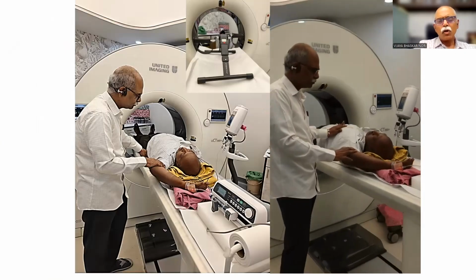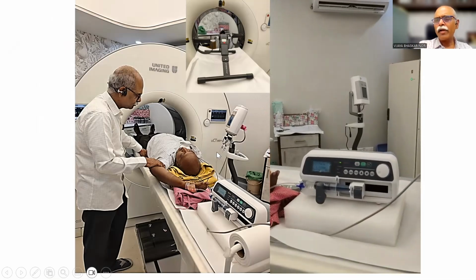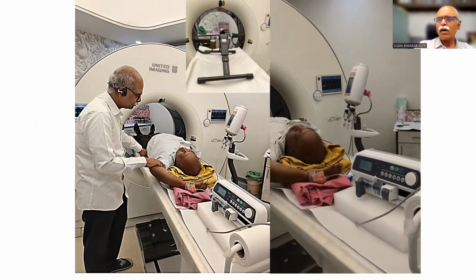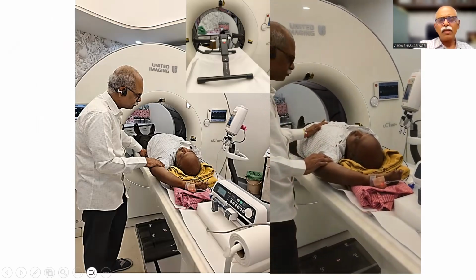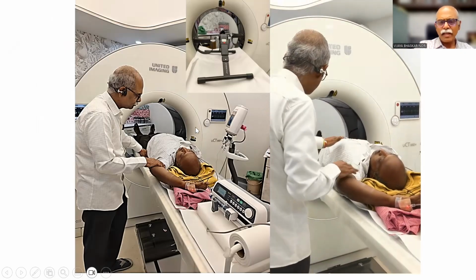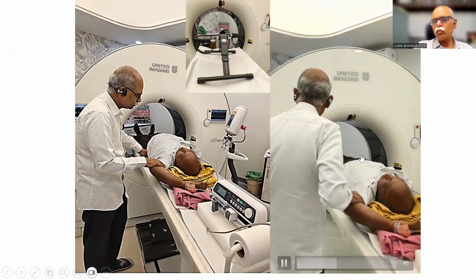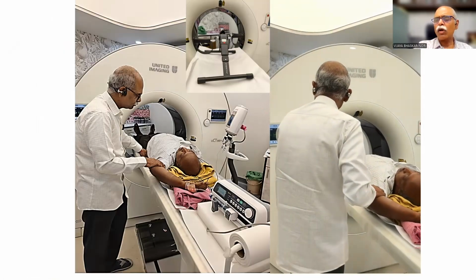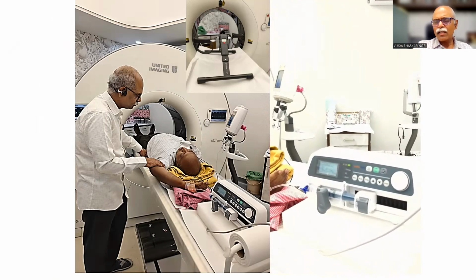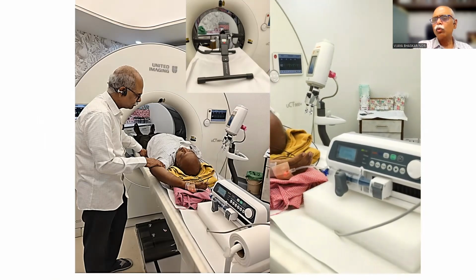Now, whenever you do a dynamic stress perfusion, the first important point is to talk to the patient and reassure them about the adenosine effects. And one important point I have learned from my senior colleague, Dr. Kumareshan, is that whenever you do a perfusion, ask the patient to do some exercise.